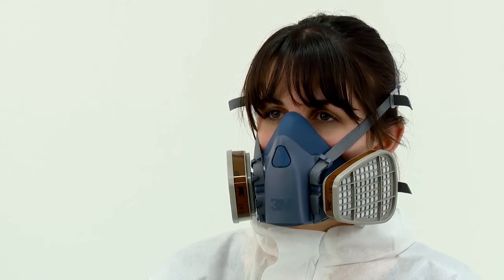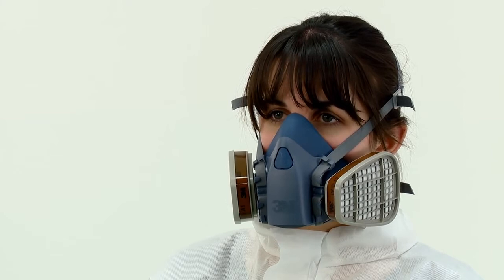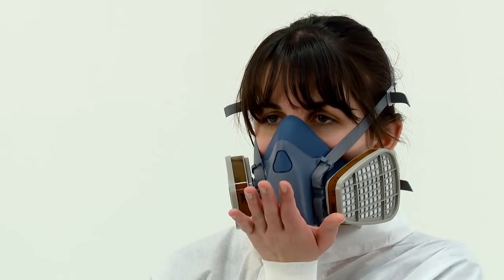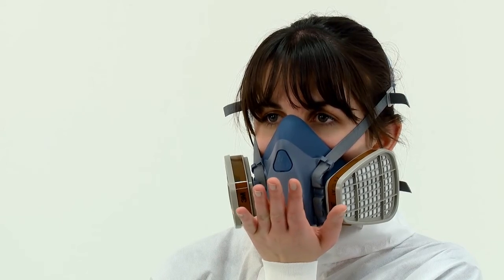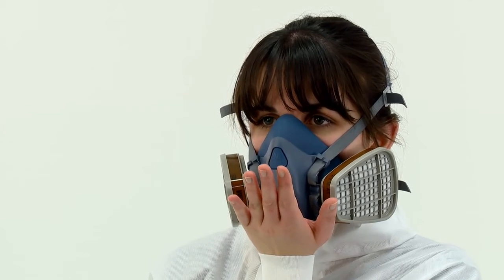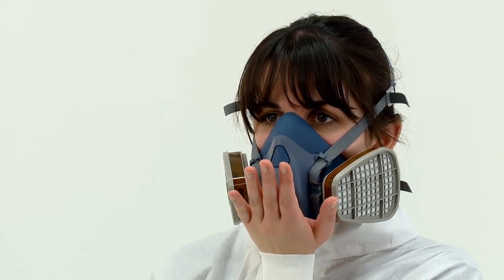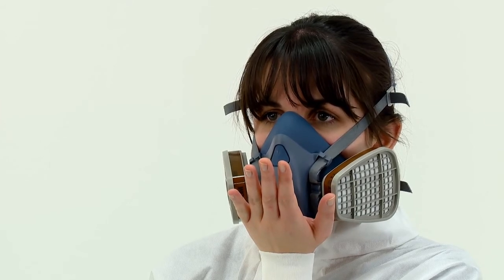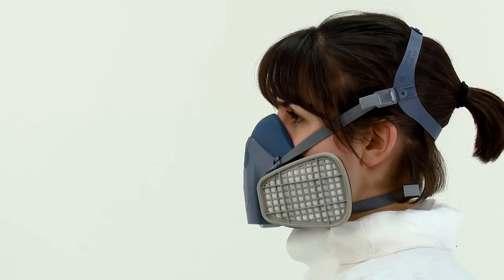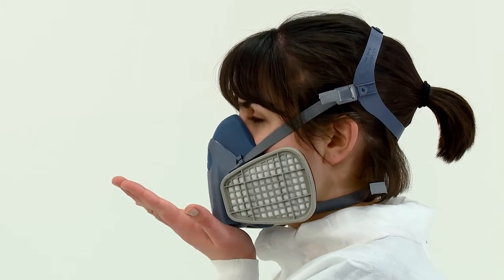If gas and vapour filters or combination filters have been fitted, a positive pressure fit check is performed by placing the palm of your hand over the exhalation valve cover, being careful not to disturb the fit of the respirator. You should then exhale gently. If the face piece bulges slightly and no air leaks are detected between the face and the face piece, a proper seal has been obtained. If it does not and you detect air leaks at the seal, adjust the fit, taking extra care with the tension adjustment of the straps, then repeat the fit check.